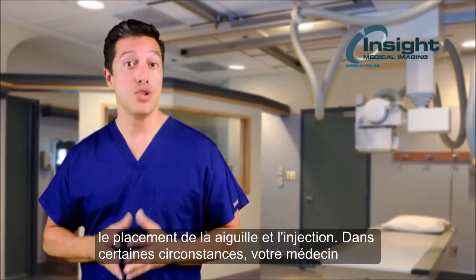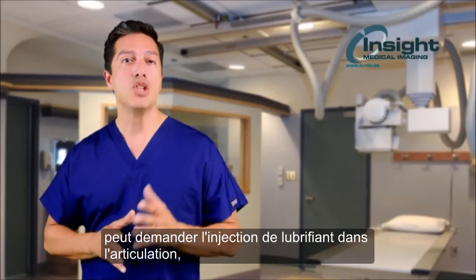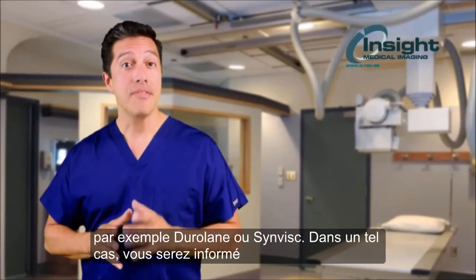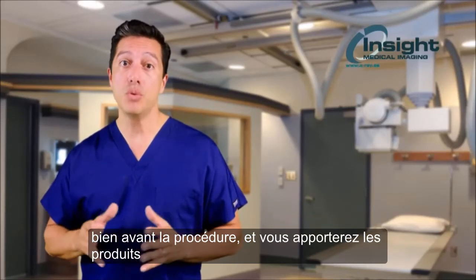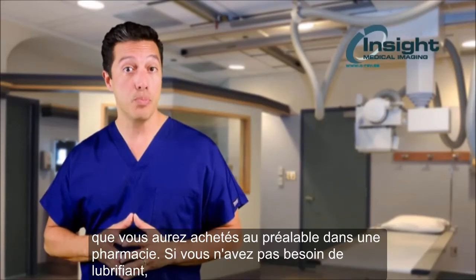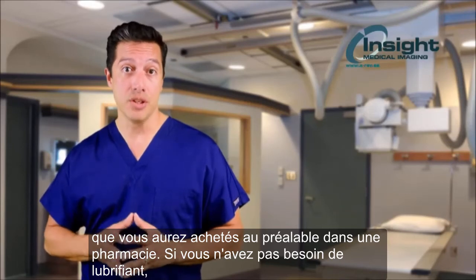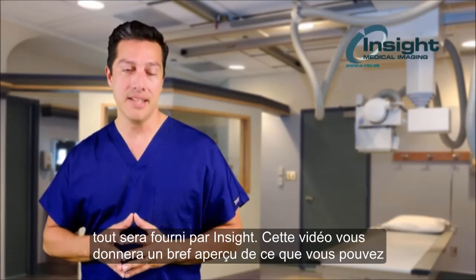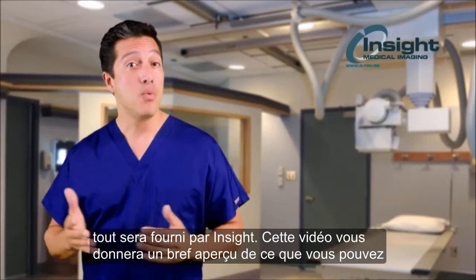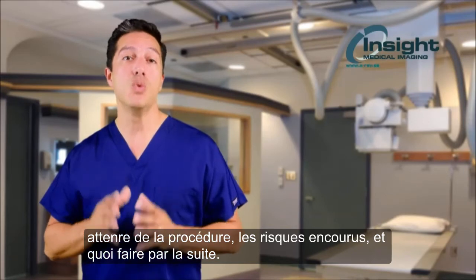In certain circumstances, your doctor may request an injection of a lubricating substance into a joint, such as Duralane or Synvisc. If you're having this type of injection performed, you will know well in advance and will bring the injection material you purchased from a pharmacy. If you're not having a lubricant injection, everything is supplied by Insight. This video will give you a brief overview of what to expect with the procedure, the risks involved, and what to do afterwards.